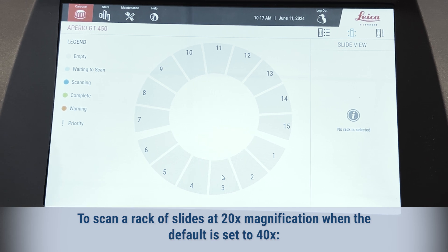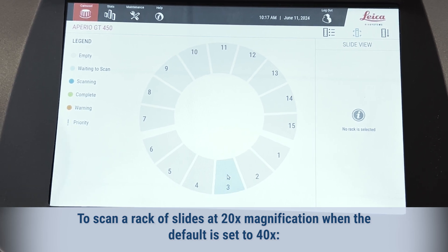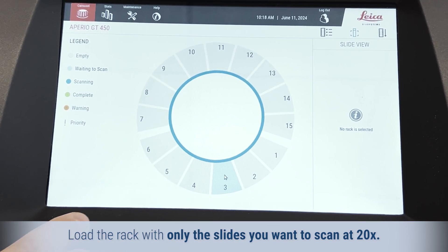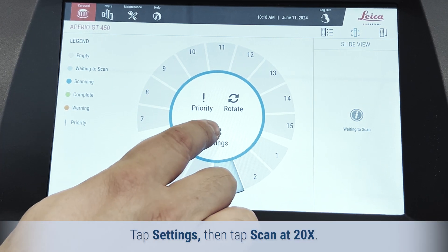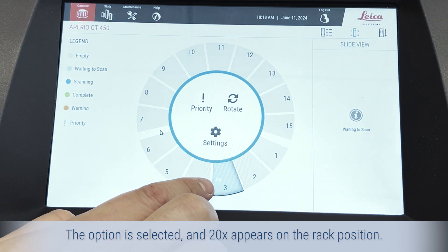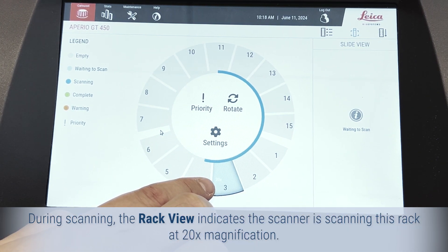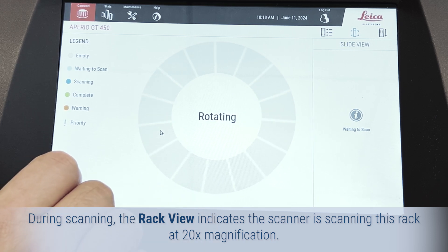To scan a rack of slides at 20x magnification when the default is set to 40x, load the rack with only the slides you want to scan at 20x. Tap the rack position that contains the slides, tap Settings, then tap Scan at 20x. The option is selected and '20x' appears on the rack position. During scanning, the rack view indicates the scanner is scanning this rack at 20x magnification.